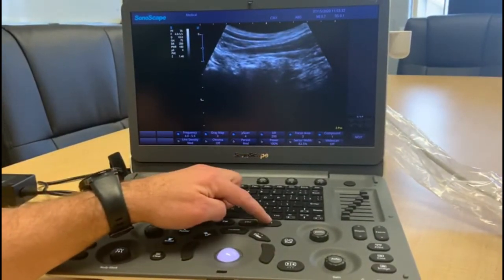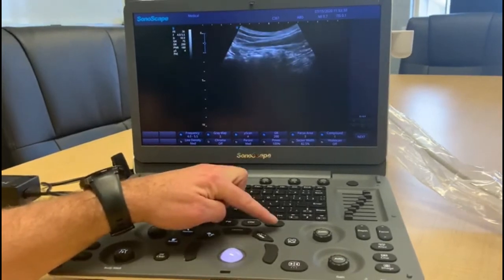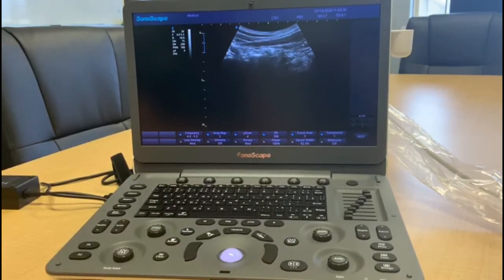To return back to your normal screen, just press the B button, and that will return us to the original screen.